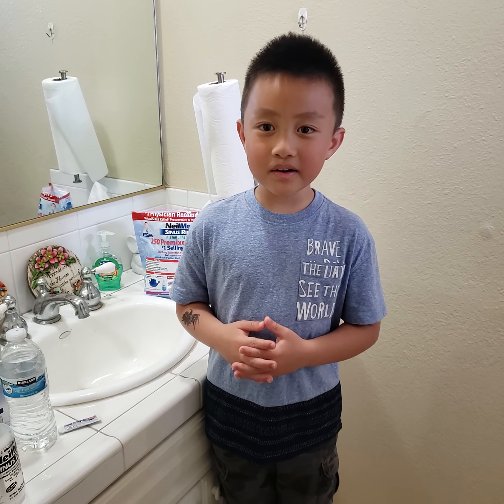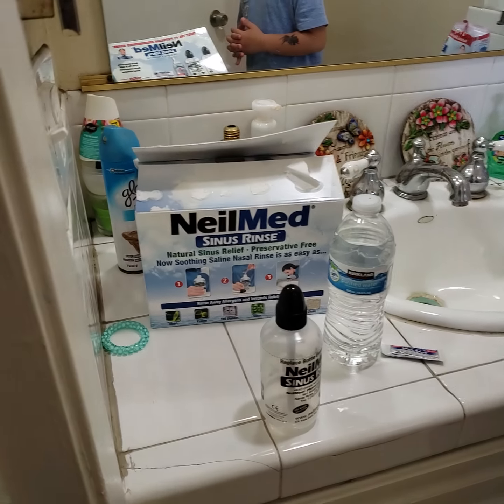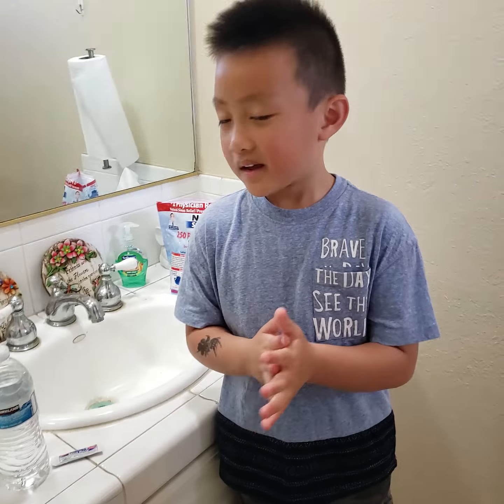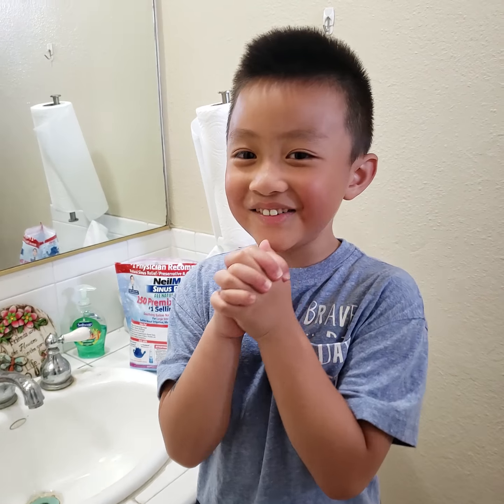Hi everybody. Today we're going to do the NeilMed Sinus Rinse for the first time in six years. Is it scary? Yeah, kind of a little.